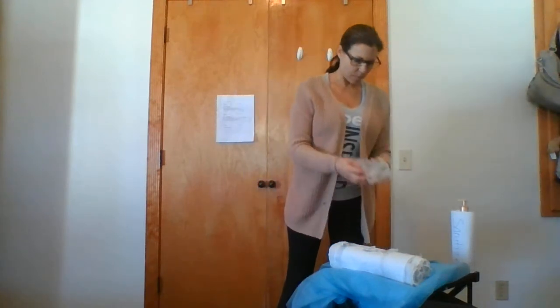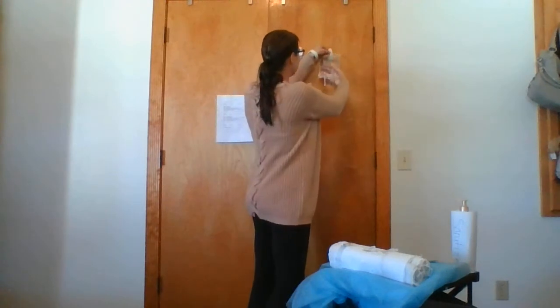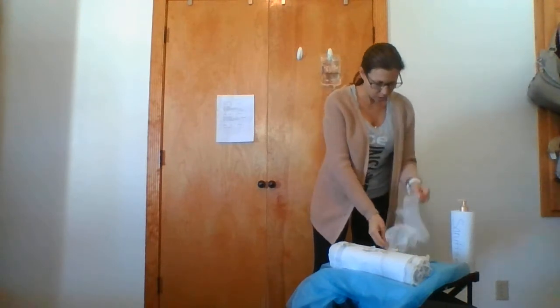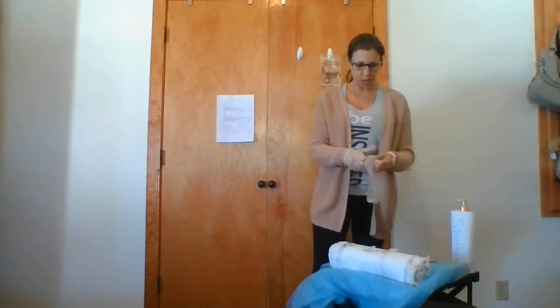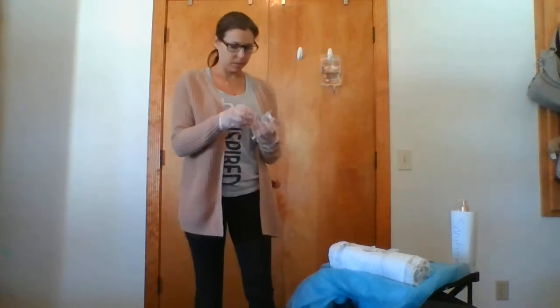Go ahead and open up my IV bag. Hang this here. Go ahead and perform hand sanitization, and don some gloves. I feel like this is better to prevent infection between me and the patient. Utilize an aseptic technique. Open up my IV tubing. Make sure you get it to where there's no kinks.